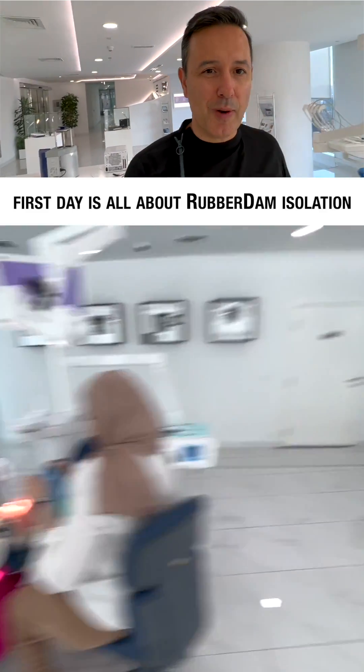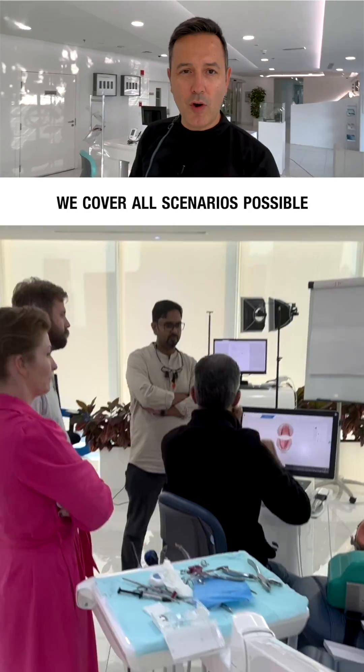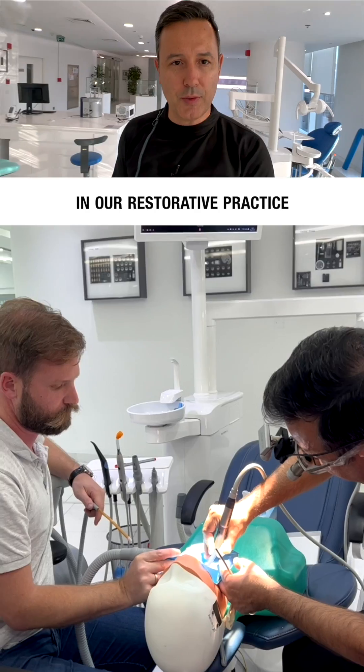First day is all about rubber dam isolation. When I say rubber dam, I mean we will consume some rubber dam sheets. We cover all scenarios possible and demonstrate how to efficiently integrate rubber dam in our restorative practice.